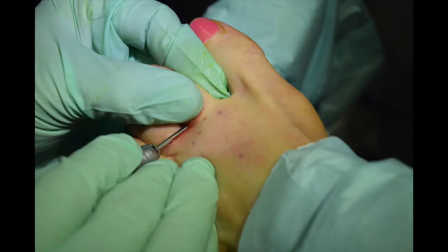We make the osteotomy on the proximal phalanx here and wedge this over. We are not cutting any of the tendons, so we're preserving the tendons and doing a correction by osteotomy only. This is the placement of the osteotomy.